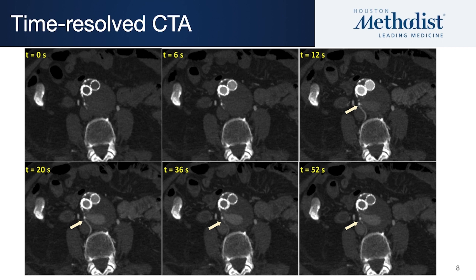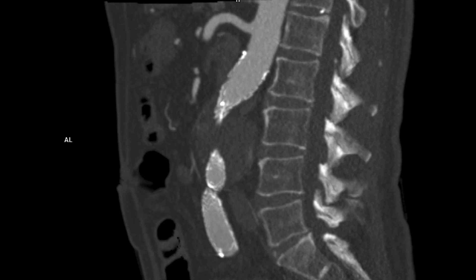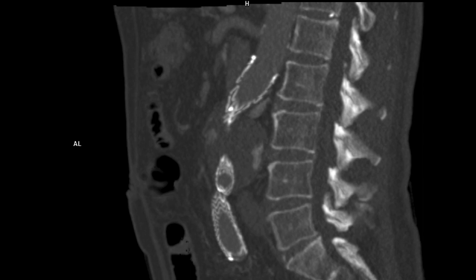Depending upon whether you take a snapshot in any part of the cycle, you may see parts of this. When we get delayed CTAs, that is often fairly randomly selected, whereas doing it this way you can actually see the flow pattern. Think of it as a series of snapshots which you can put together to make a movie. Dye is in the SMA, in the proximal aortic neck, and in the aortic endograft where it divides. You can see dye behind the neck — it may look like a T1 endoleak, but it's actually a retro-aortic left renal vein. You can reconstruct this three-dimensionally and know exactly where it is.